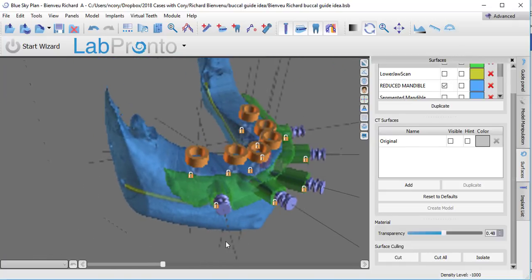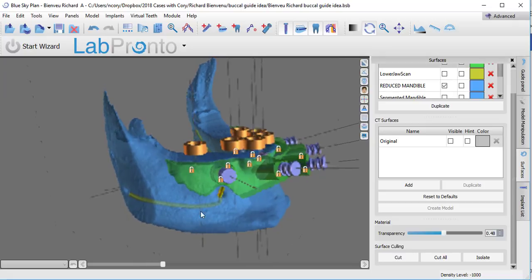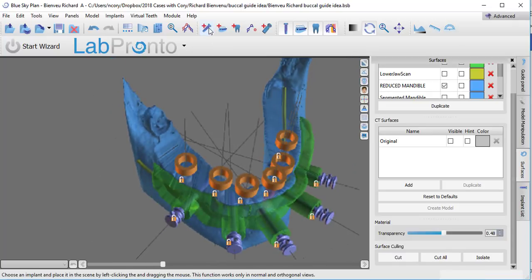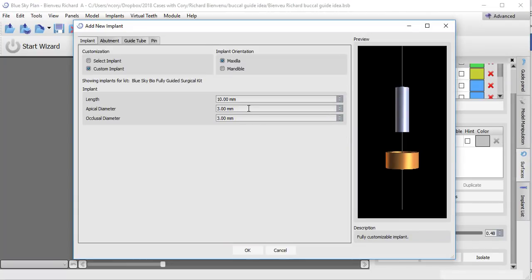But if you'd just rather stay purely within Blue Sky Plan, think of how you could insert an object that would now connect these tubes to this. Well, one thing we could do is just insert a bunch of custom implants. So if I went up here to add an implant, I could choose a custom implant. We can start out with a length of 10, and that's probably a good starting point. But if this is printed resin, we probably want a diameter of about 3 millimeters.